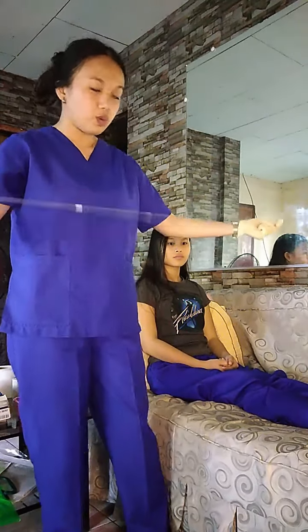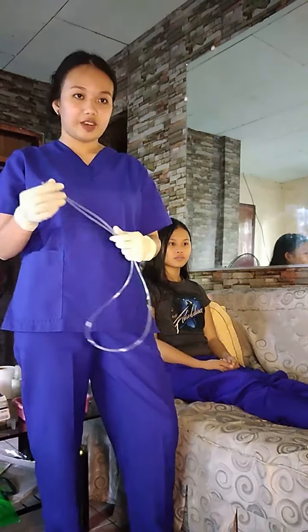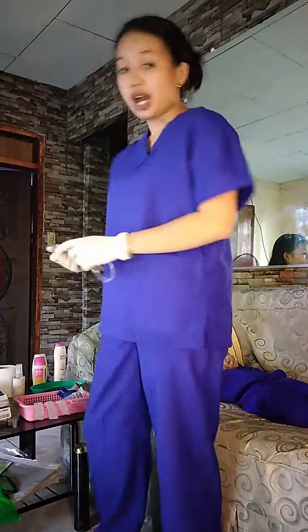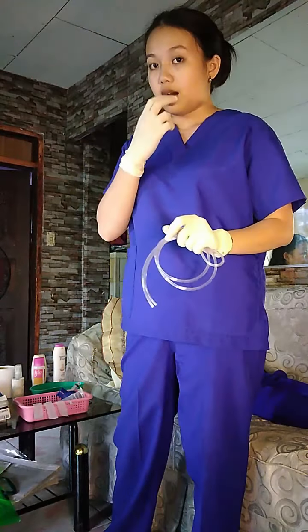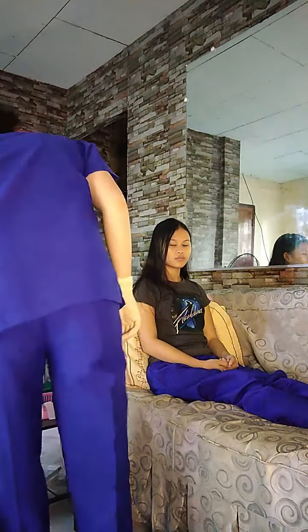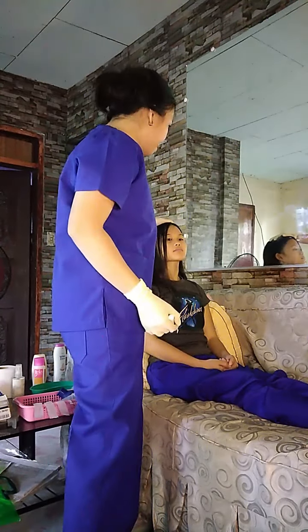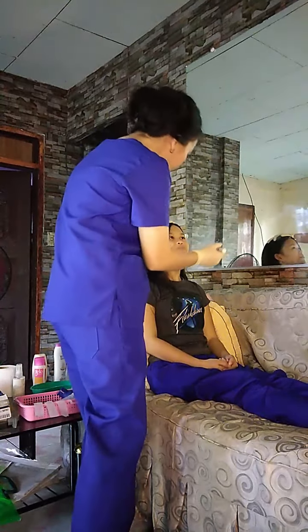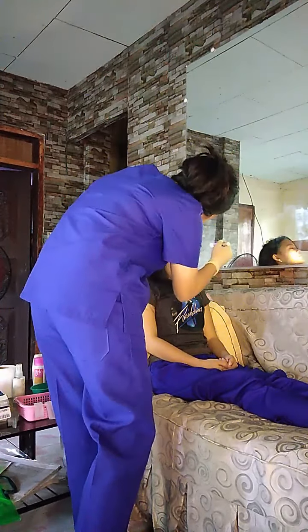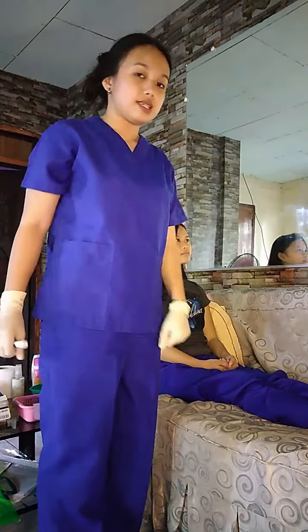So, assuming na ito yung NGT na gagamitin ko, pagkatapos kong i-identify kung ano yung size ng tubing, ang sunod ko namang gagawin is i-identify ko kung aling nostril ang i-insertan ko ng tubing. Using a pen light, ititilt ko yung head ni Ma'am Cassandra and then i-check ko yung nostrils niya, both nostrils. So, what I'm looking for is any obstruction or deformity in the nasal septum.